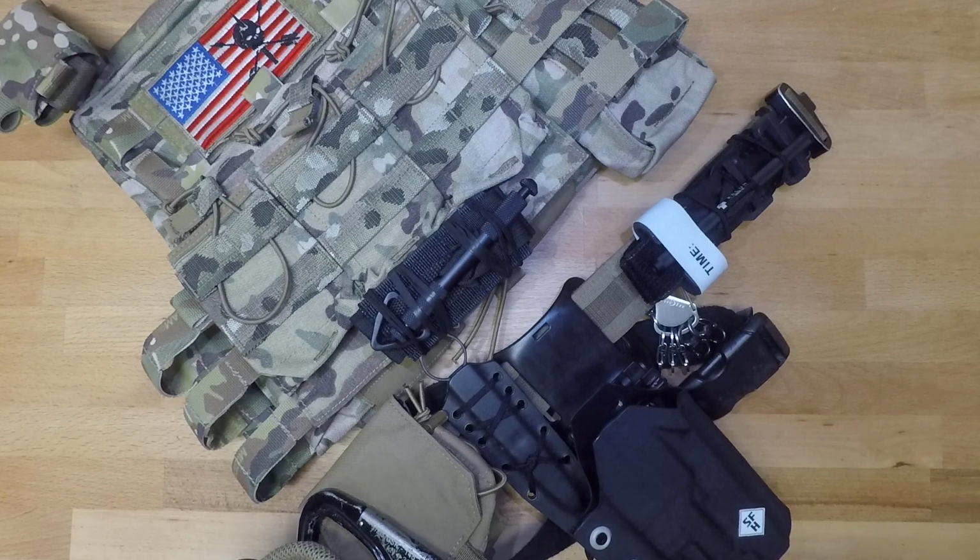I've seen countless debates and arguments over SOPs, especially on the conventional side, and conventional leadership trying to force dudes to put their tourniquets in ankle pockets, cargo pockets, and shoulder pockets. And I can tell you that it's probably one of the stupidest SOPs known to man, because there are plenty of examples of guys getting injured and a limb being injured and that tourniquet being rendered completely useless because it was damaged in a blast, explosion, or it was shot. Or the worst case scenario is a guy's limb gets completely blown off and that tourniquet goes with that severed limb.